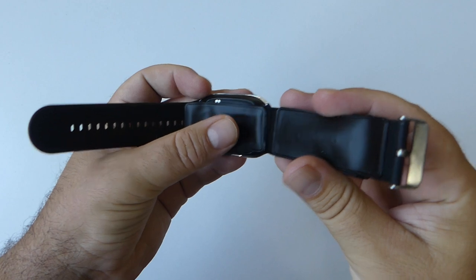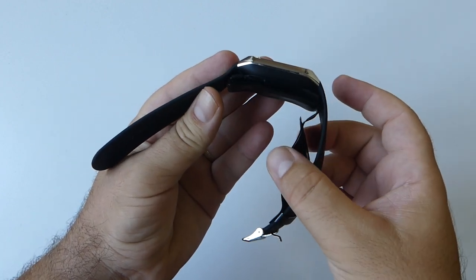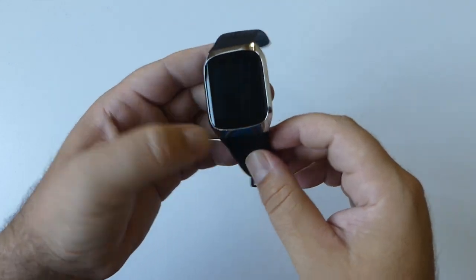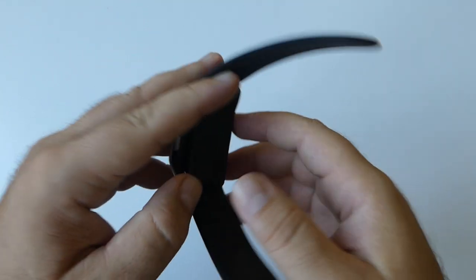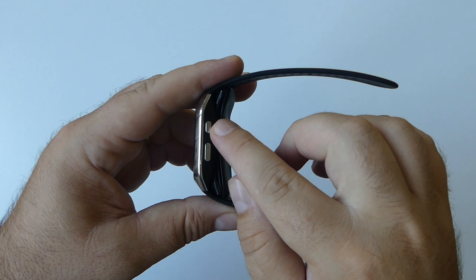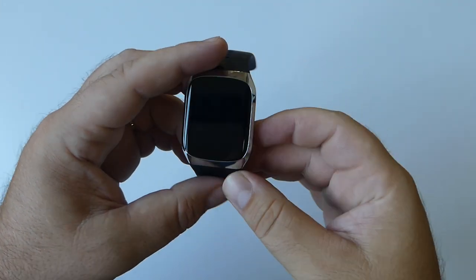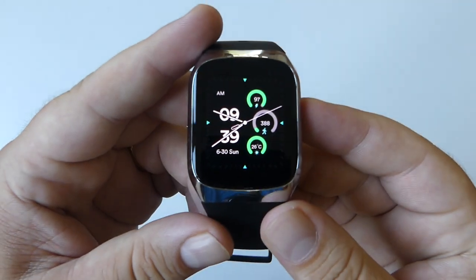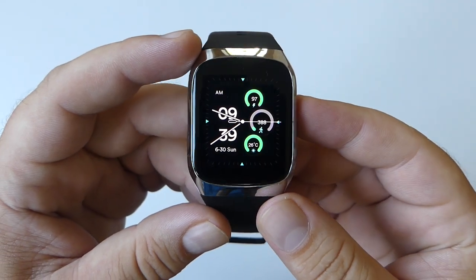BP Dr. Med enables medical grade wrist blood pressure measurements anytime and anywhere. On the side you'll find the charging port and two buttons — one to turn the watch on and off, and the second to access the main menu. Pressing the top button gives you access to the main display, which is a gorgeous 1.61-inch AMOLED screen with a resolution of 320 by 360.